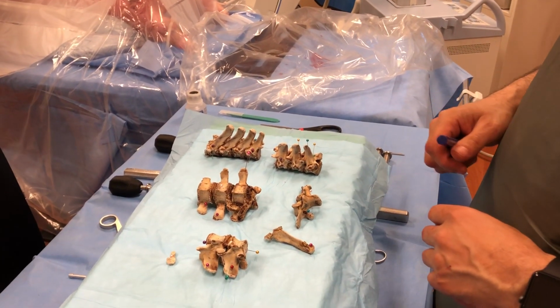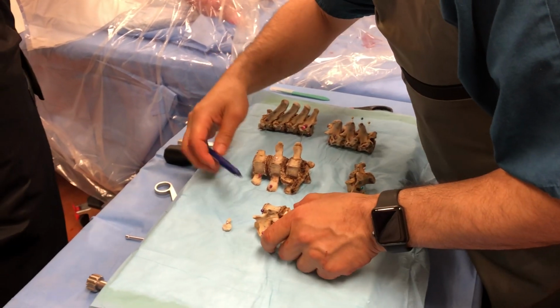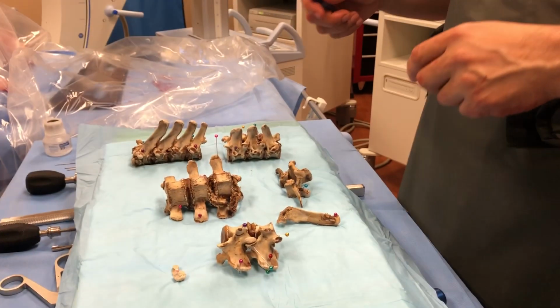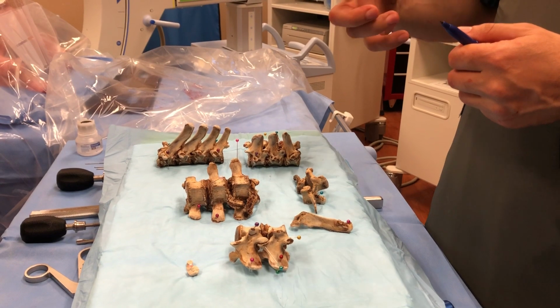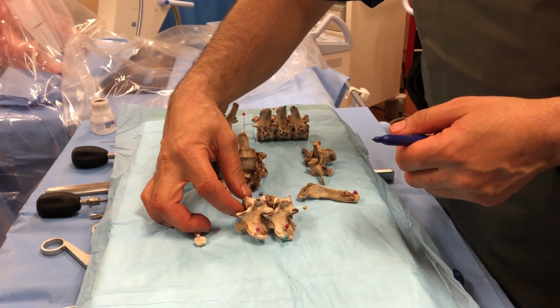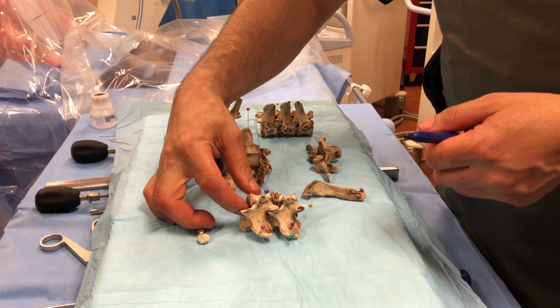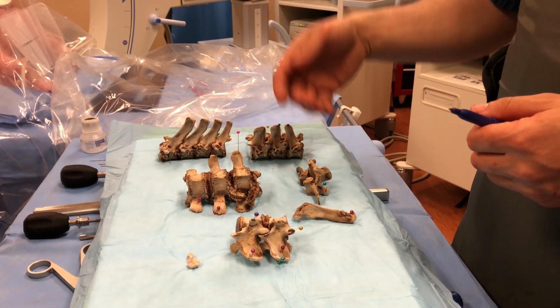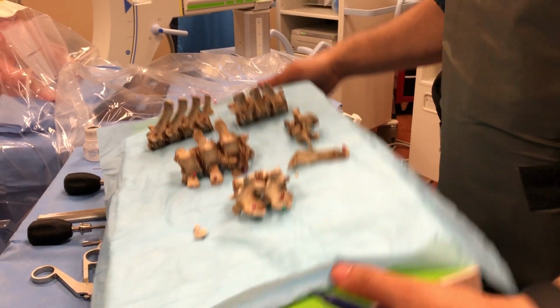One other important difference is the depth of the vertebral body. Since the pig is on all fours and we are human, we are upright, the depth in human is probably 30 to 35% more than in pig. So in a pig, we did a usual OLIF approach here.